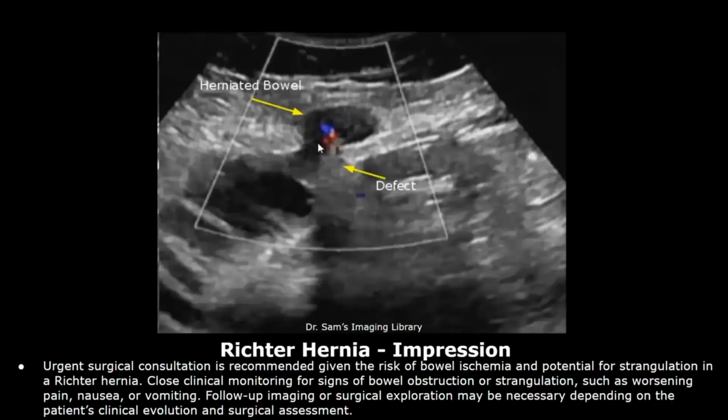Close clinical monitoring for signs of bowel obstruction or strangulation, such as worsening pain, nausea, or vomiting. Follow-up imaging or surgical exploration may be necessary depending on the patient's clinical evolution and surgical assessment.